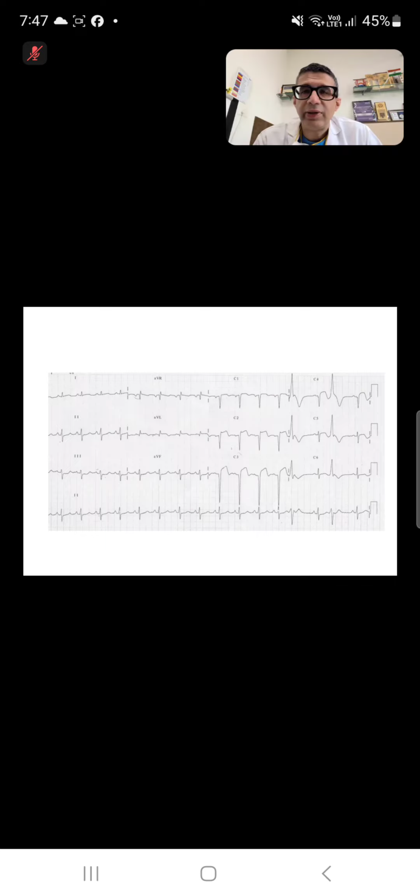So again, to emphasize how difficult it is to get into this habit unless you keep practicing. For every ECG, what is obvious, you'll be able to pick up. But there are certain abnormalities of ECG where things are not obvious. And there, when you don't follow this process, you'll tend to miss. So both reading the ECG as well as writing the diagnosis of ECG are extremely important for you to practice repeatedly. Once you keep doing it for multiple cases, then it becomes easy.